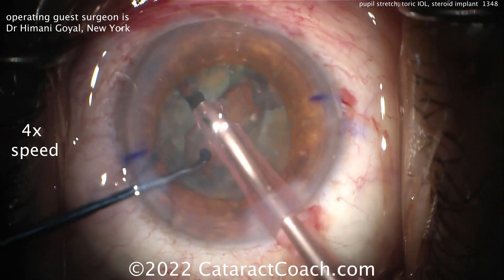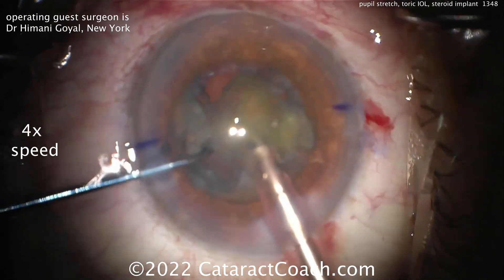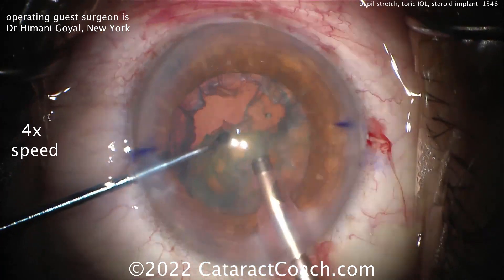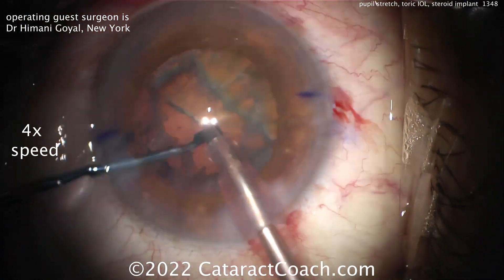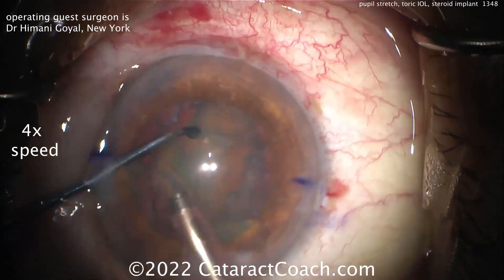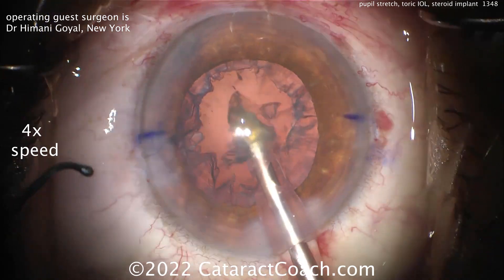Now a little bit of a divide and conquer technique — another small groove and another split. Now the pieces can be removed. Taking out the first quarter, then the second quarter, and everything looks great. Here comes the last half, which is chopped. So a combo between stop and chop and divide and conquer — halfway between the two techniques.